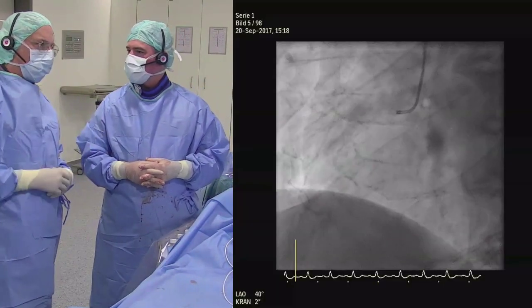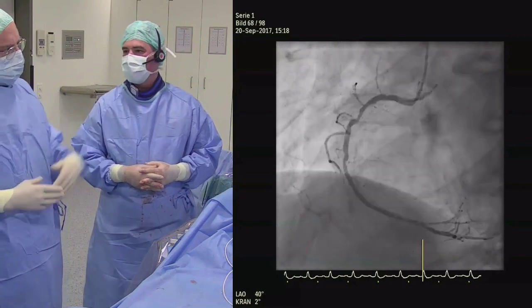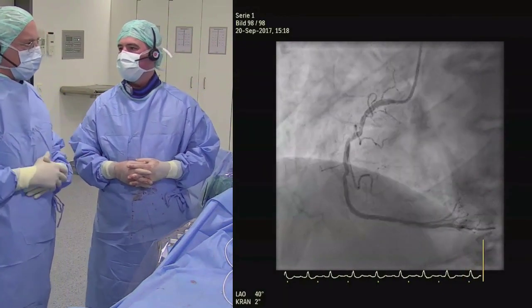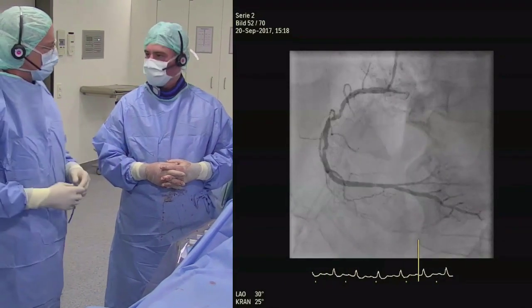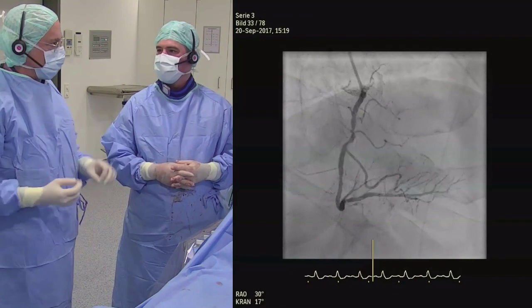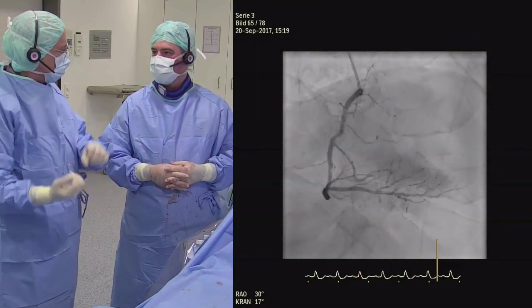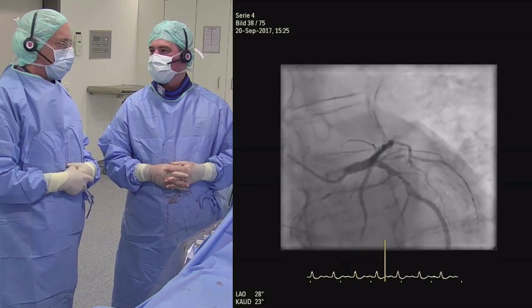I don't know how you do it. Would you normally start with 5 French in this case? Here, where you've got a bit of a sharp bend, there is some question whether you're going to have to put some more muscle in to get it down. If you're using 5 French, you'd probably have to put the guide down into the coronary if you got caught around the bend. So there's some good logic to that.